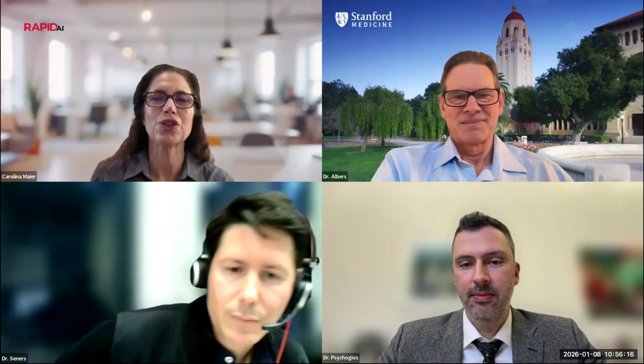Fantastic. Thank you. I'm going to move now to Pierre. How do you use collateral assessment to determine which patients should or should not be transferred to a comprehensive stroke center? I know you covered some of that already, but can you give us a summary here? Yes, that's a very important but difficult question. I don't think that we should use perfusion imaging alone to decide whether or not to transfer a patient for thrombectomy. Of course, I think perfusion clearly helps.